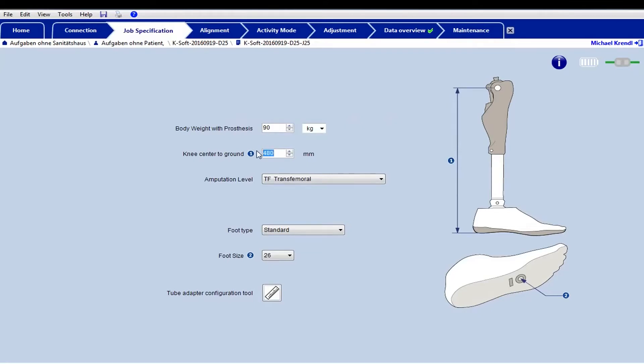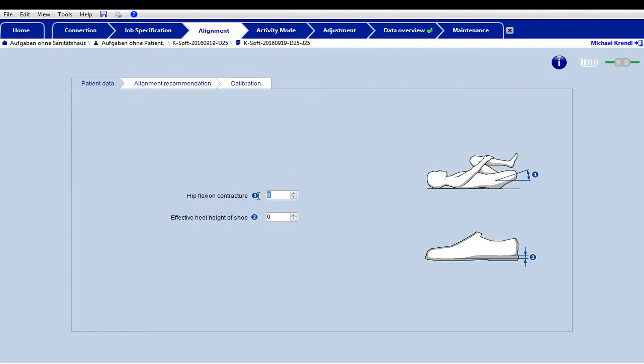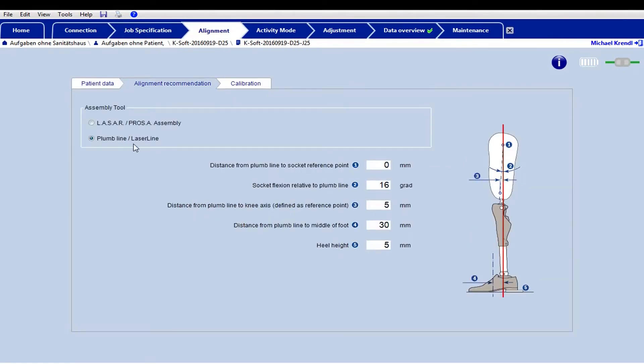Enter the patient's data in the software. The value specified in the alignment recommendation should be transferred to the bench alignment. If you are not using an alignment tool, please observe the alignment recommendation for the bench alignment in the software.